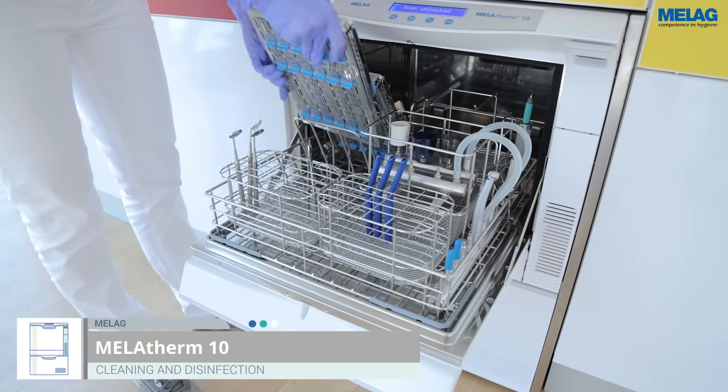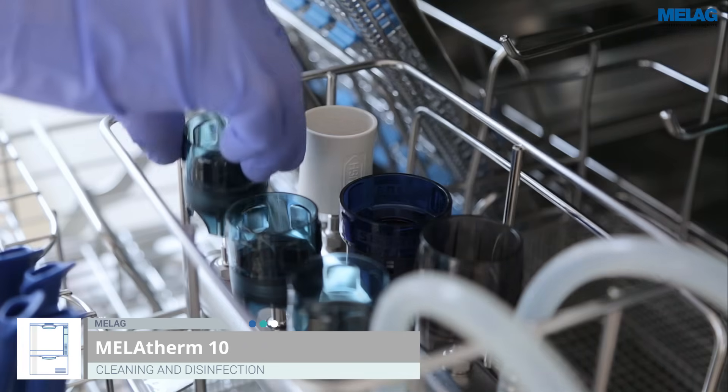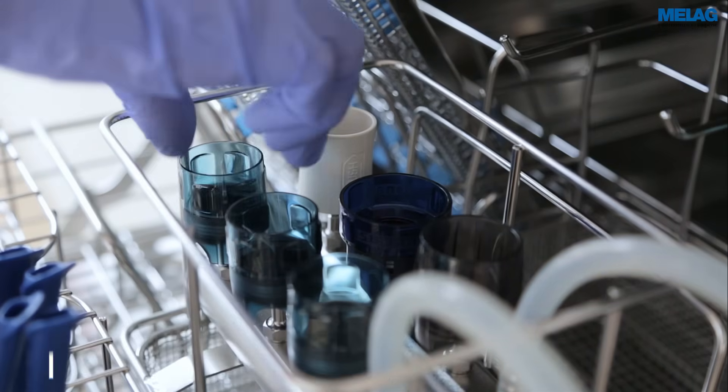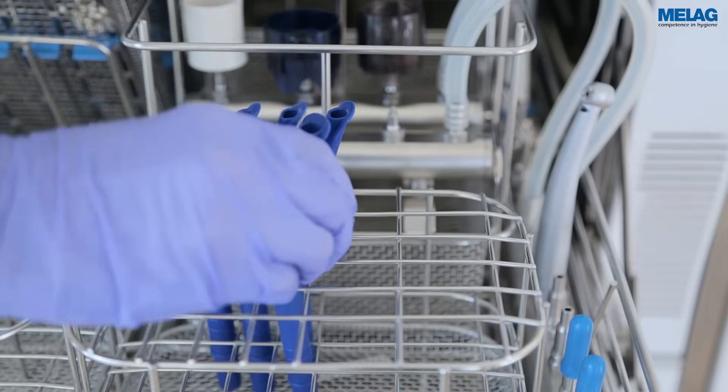With over 80 specially adapted types of insert baskets and further accessories, the practice-optimised washing chamber of the MeLag Therm 10 can be adapted to the individual user's needs.